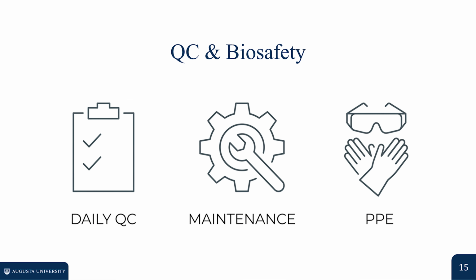Maintaining analytical integrity requires strict adherence to daily quality control, preventative maintenance, and biosafety standards. Each day begins with running particle-free background counts, verifying the WBC background is 0.1 or less, RBC is 0.02 or less, hemoglobin is 0.1 or less, and platelet background is less than 10.